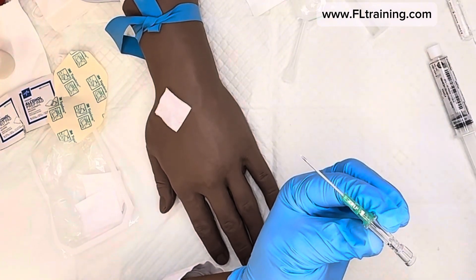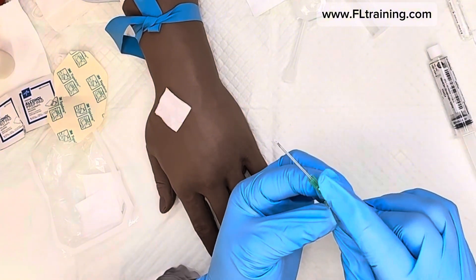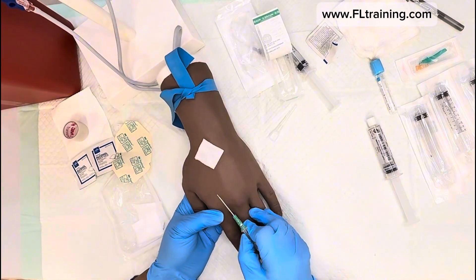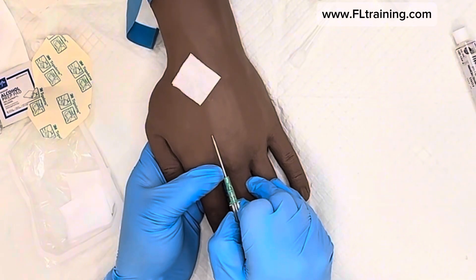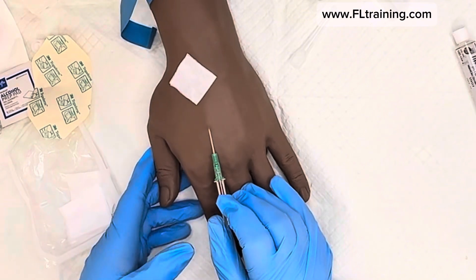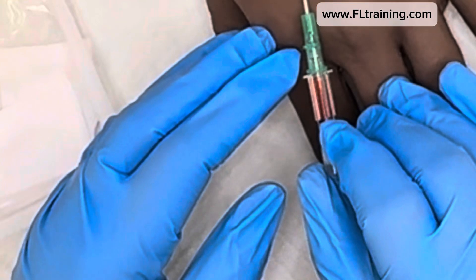The only part that stays in the patient is the catheter — the plastic part. You're removing the metal. Educate your patient and let them know they'll feel a stick — don't say it won't hurt because it probably will. I like to pull the skin down taut and go in on three: one, two, three. Once you're in, pause for a moment — I already have backflash, which is the goal.